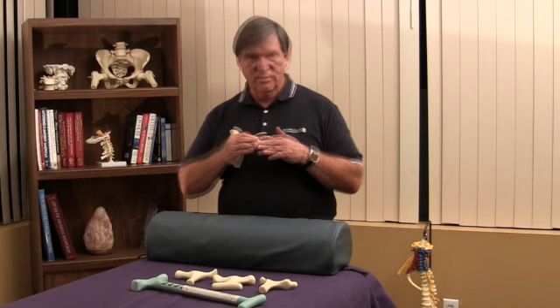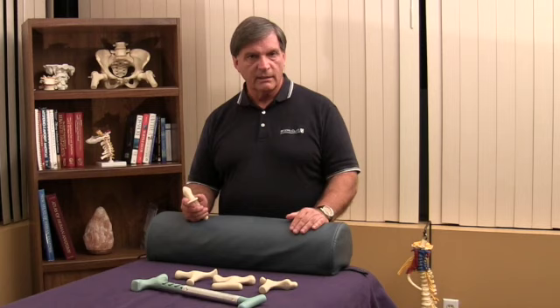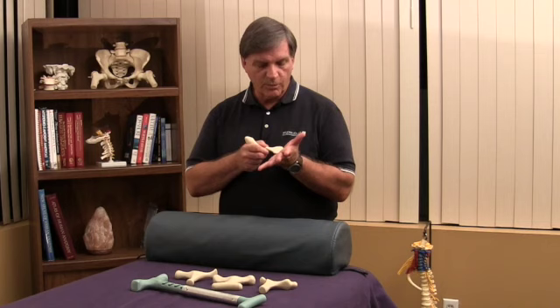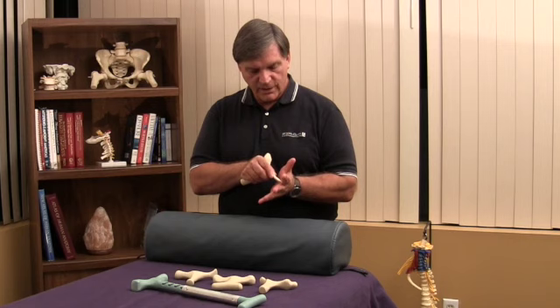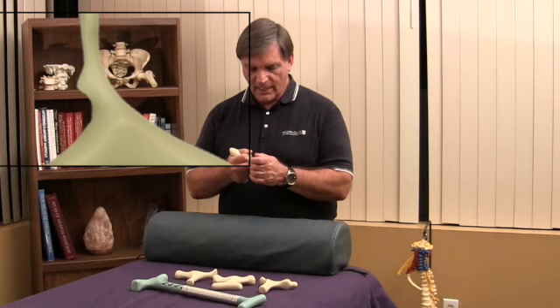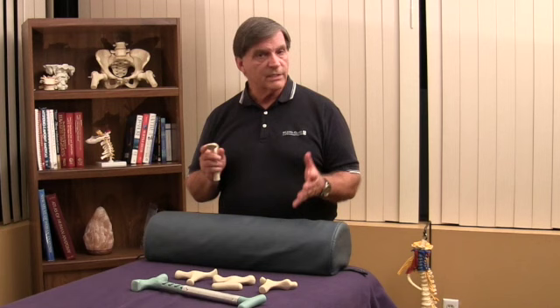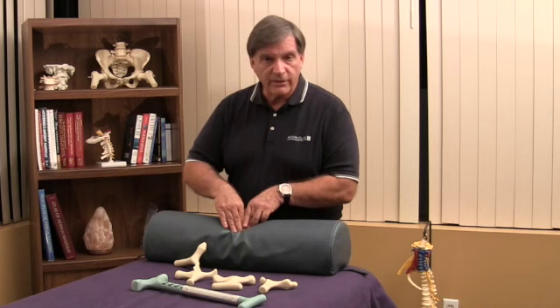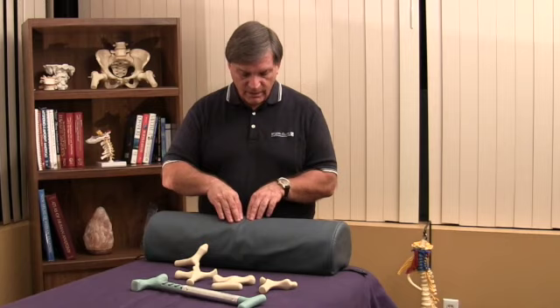Pressing on the ends and fingers and joints, compressing the joints, can cause a great deal of discomfort and deterioration of the joint. When you have a tool like this that can extend fascia, open up fascia, tendons, ligaments, go in between the phalanges — every thought process that Merrill has used in designing and applicating, even this little hump right here, allows you to grip the tool with control, just the way you would use your own fingers, but minimizing the pressure that would compress each joint up into your fingers and wrist.